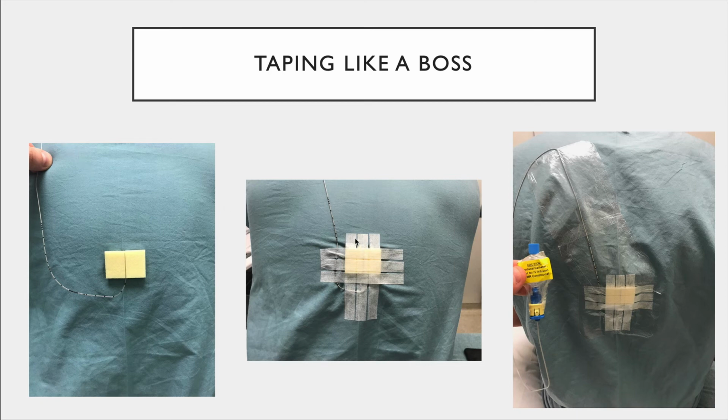With the Steri-Strips, you can take a set of 3, and inside the Steri-Strip pack, there's 2 sets of 3. If you run them one horizontal and one longitudinal, one vertical, one horizontal, it creates a nice seal around this little pad here. You can capture the wire, or not the wire, but the epidural catheter as it runs up as well.